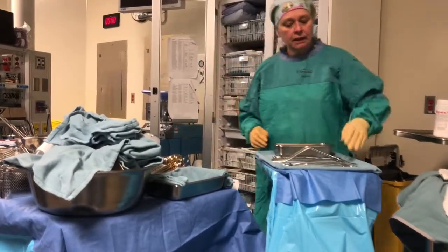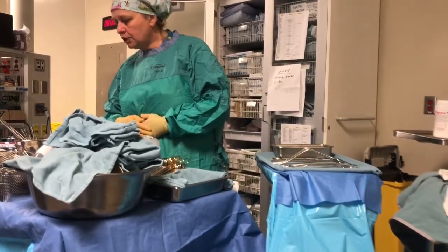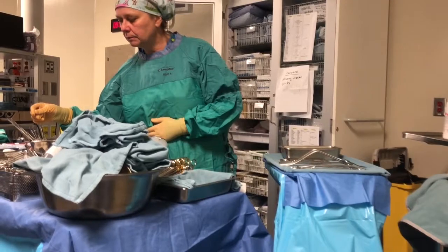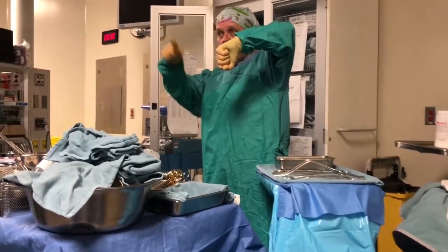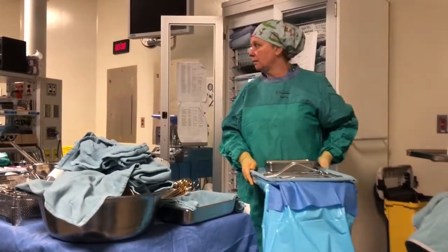So I would have that. I would start off with, for a retractor, I would probably start off with just 4-prong, so that they could just hold the tissue back and they can dissect, right? And that's basically all I would have on my table.